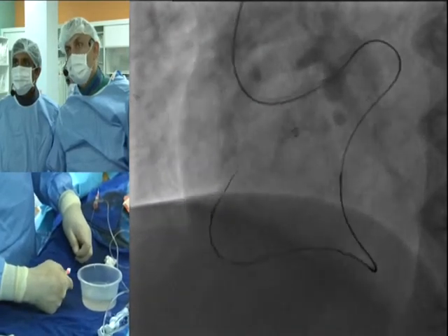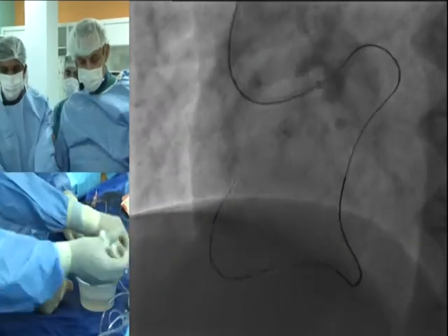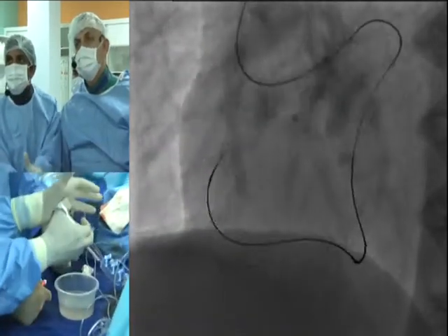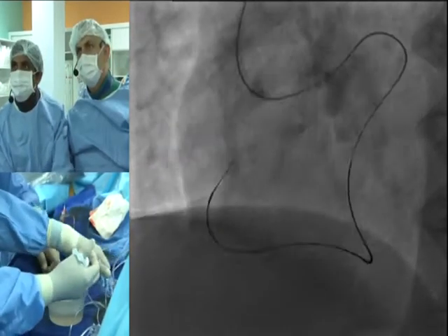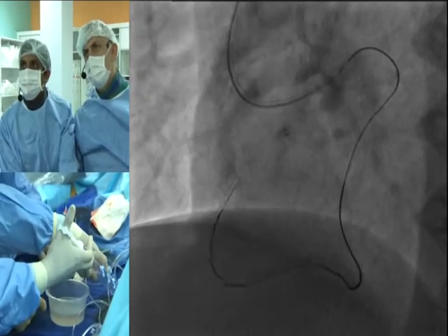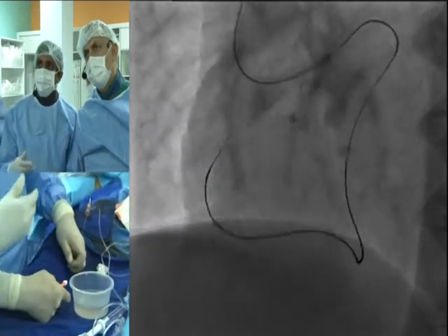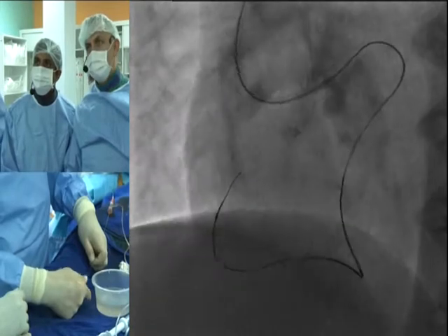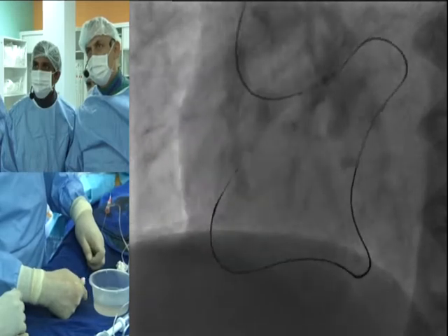And here can I see some antegrade flow from our RCA? Okay. So the direction is not bad. We essentially have to poke the distal cap and then the proximal cap. As you see, Gaia is moving slowly.